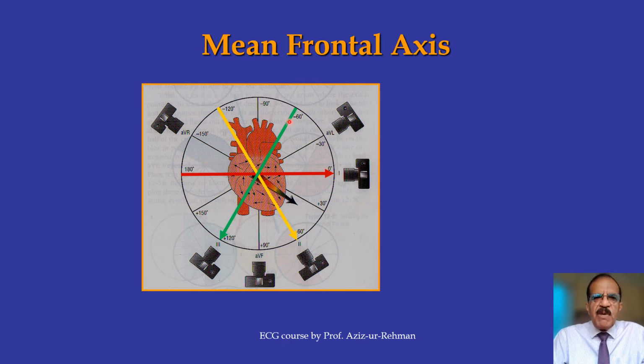So in this picture, we have now placed 3 leads representing our frontal cardiac axis, with 60 degree angle between them. Can you notice this angle? There are numerous small arrows, but one big one. This means that these small arrows are actually the depolarization process. It passes through various angles and directions, but ultimately it makes one big mean axis. This is what we're going to determine.